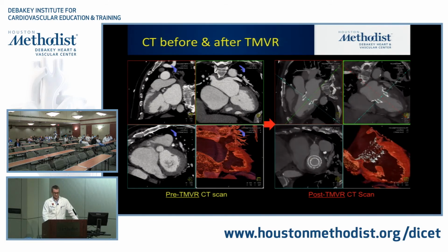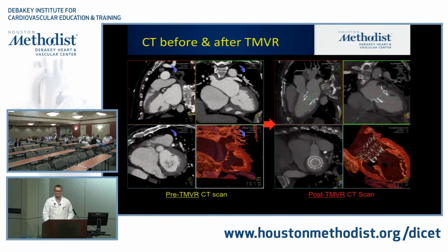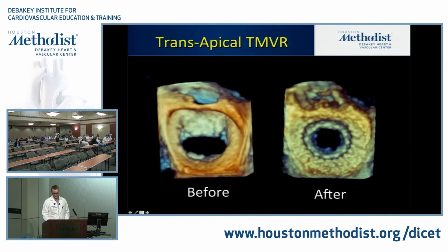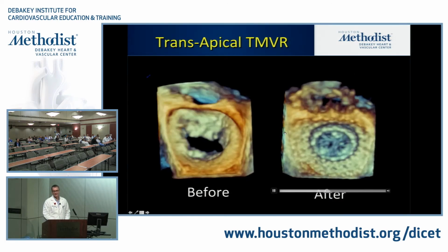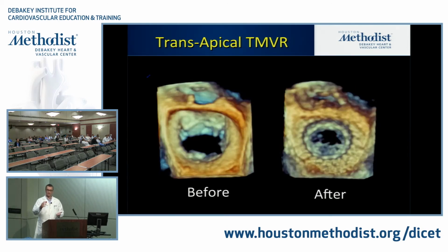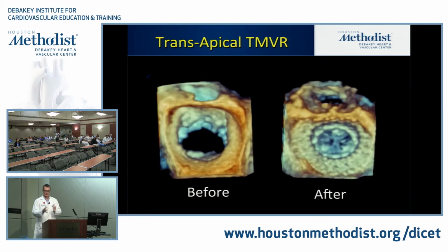mitral regurgitation. Excuse me? Yes, you're excused. I've read that at other centers. And there's annular motion too. The annular motion is important for the whole ventricular function. You've got to compress this way as well as this way, so for sure.